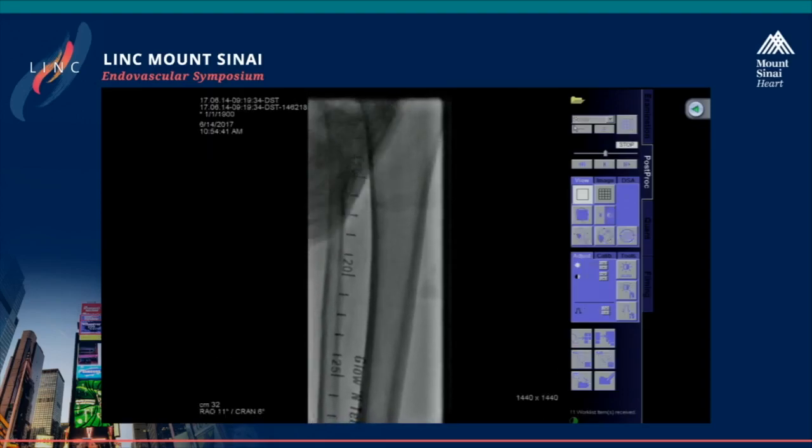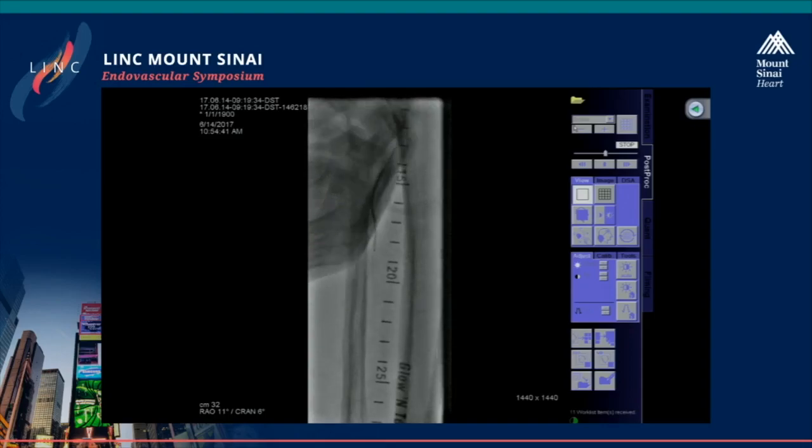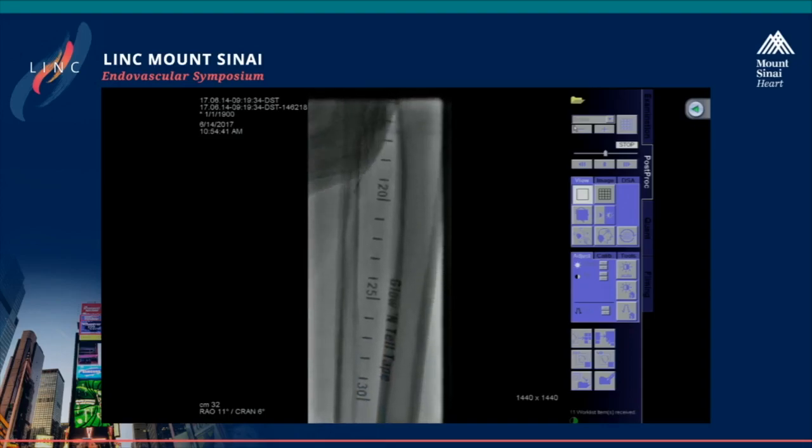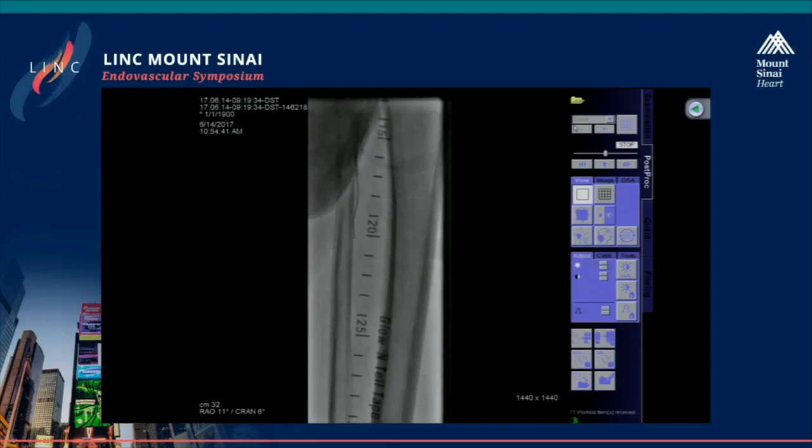I think that the technique you use is great, and that's exactly what I would do as well. And I think there's a real advantage to using an 035 catheter in these types of situations with an angle on it. And whether you use a CTO wire or a Glide wire, Advantage or Command, or hydrophilic wire, I think the trick that you did there is you engaged the lesion, you turned away from the collaterals, and you tried to pop through.